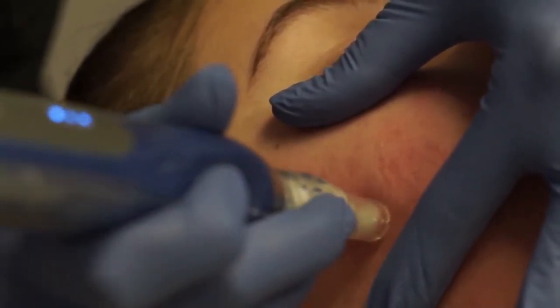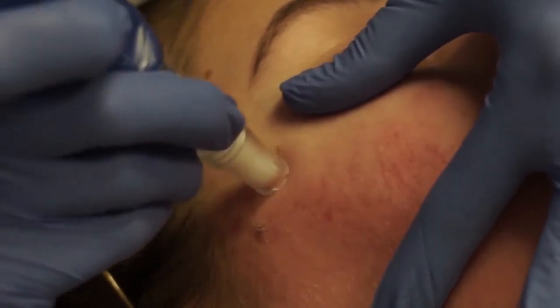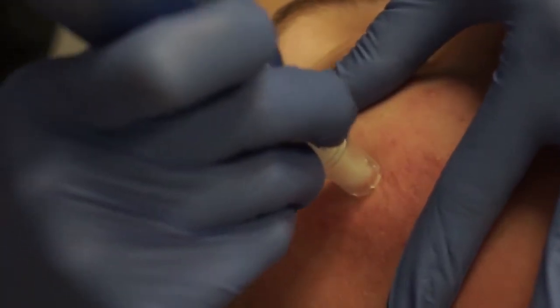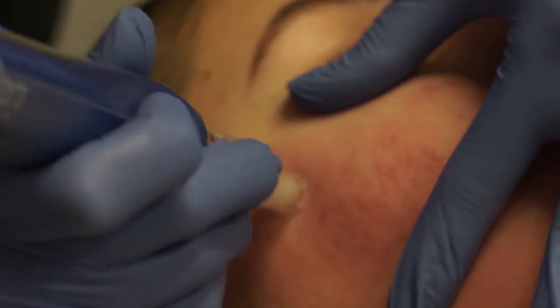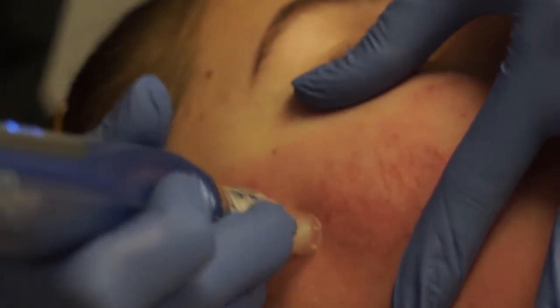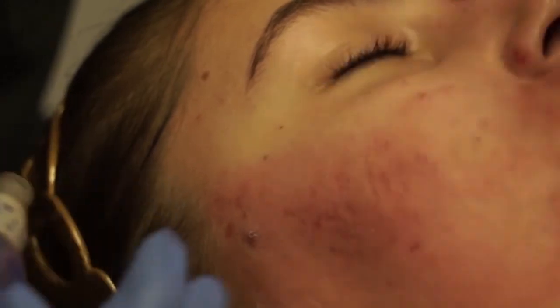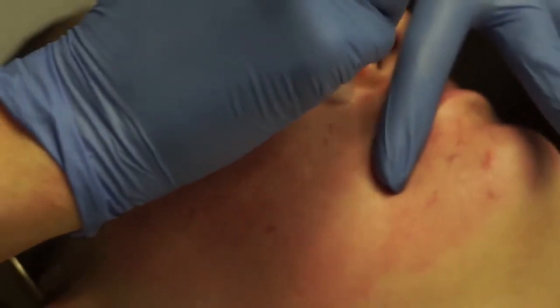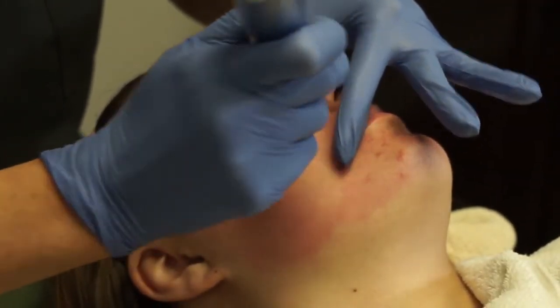Should you need to dial up to higher depths, it is important to recall that the motor in the SkinPen revs consistently at 7,000 RPMs at all depths, regardless of skin density, and the needles are calibrated to penetrate to precisely the depth dialed on each rotation. That means that you may need to slow down your motion to a slow glide or even a stamping motion to ensure the depth penetration is met in your target area and there is no skipping that occurs.